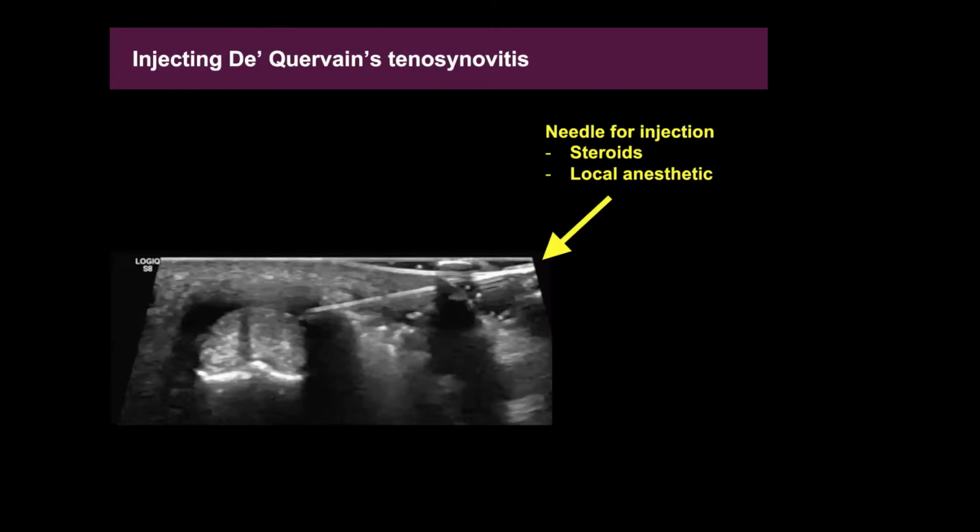And just like cases of the biceps tenosynovitis, if the patients are suffering from pain and discomfort, you could use your ultrasound to guide your needle injection. Fair warning, these patients really, really hate it when you stick that needle into that tenosynovitis because they're exquisitely tender and inflamed. So I usually give my patients fair warning, and when they invariably jump, just make sure you don't stab yourself, because as you can see, this is a very superficial injection. So if the patient abruptly moves, your needle could just pop out of the patient, and if you're applying force in a direction, you could end up stabbing yourself. So I would just be careful when you're injecting the patient's first extensor compartment.